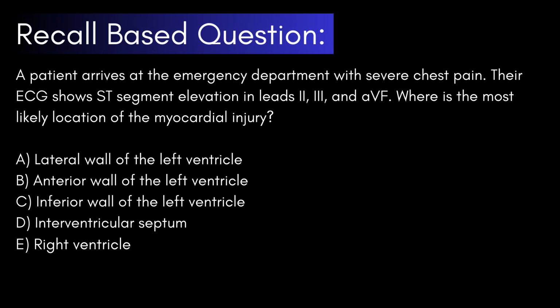A patient arrives at the emergency department with severe chest pain. Their ECG shows ST segment elevation in leads 2, 3, and aVF. Where is the most likely location of the myocardial injury?